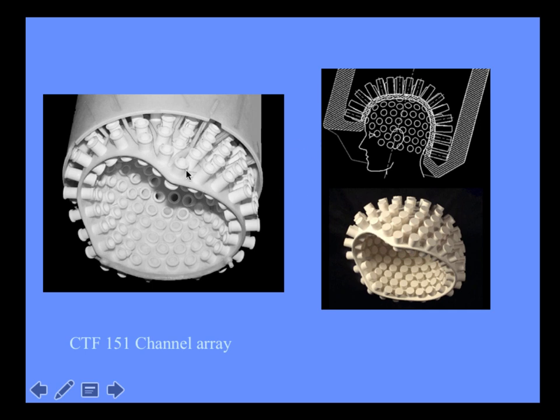So the gradiometers are wound on a little spindle here. The one coil is down here, and the counterwound coil is here. And then these wires are led up to the SQUIDs themselves. This is actually from CTF. The original company that made our machine was called CTF.